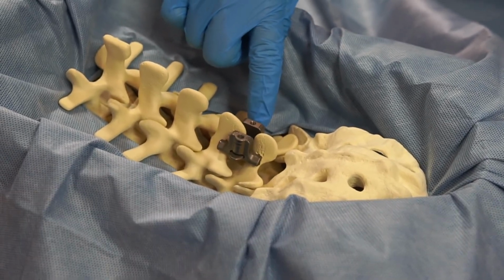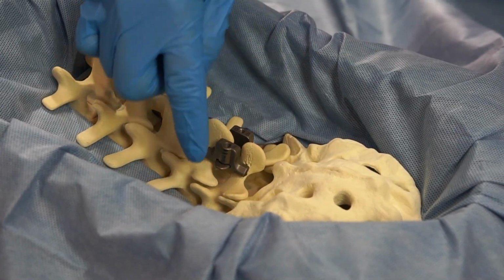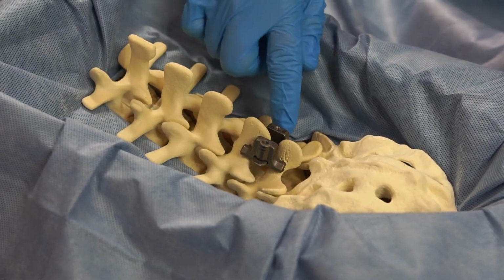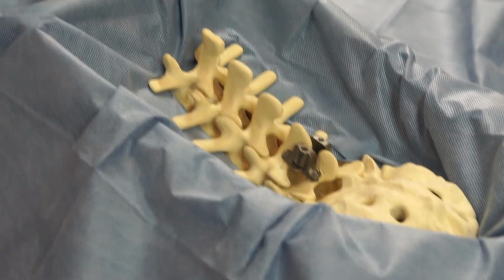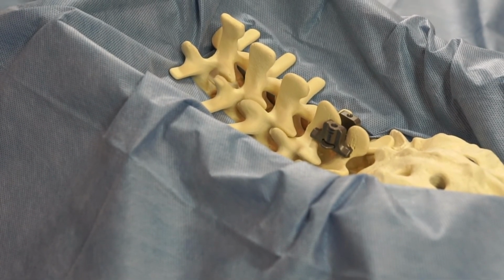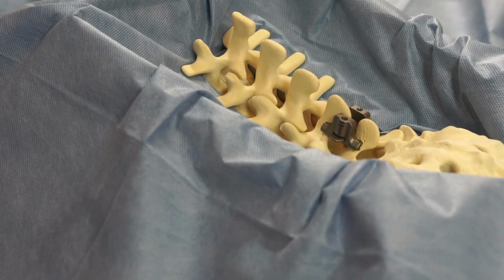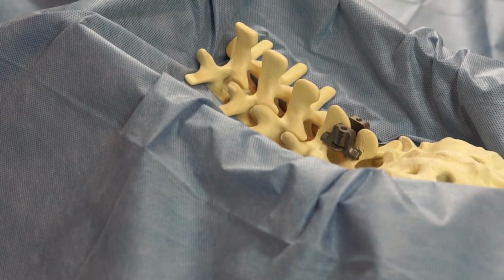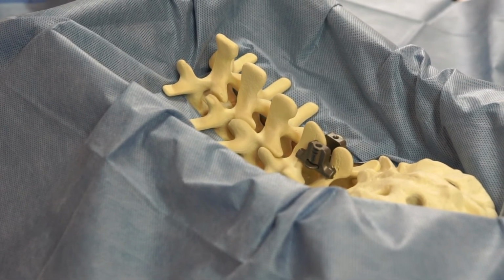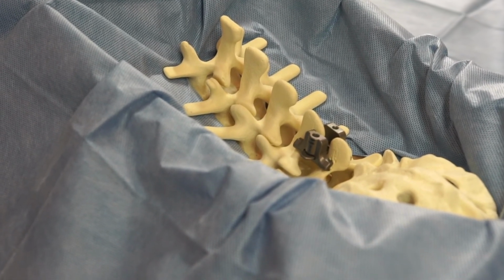If desired, additional posterior bone grafting material may be placed around the implant, in the posterior lateral gutter, and/or across the interlaminar space. After the construct is implanted and bone graft completed, close the surgical site using standard techniques. If the supraspinous ligament was reflected, it may be sutured back to the tips of the spinous process. The fascia may be closed back to the supraspinous ligament.